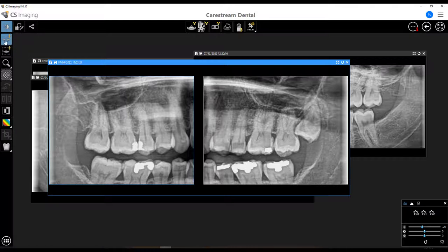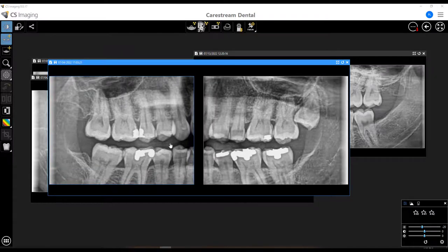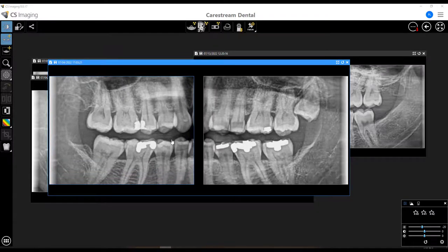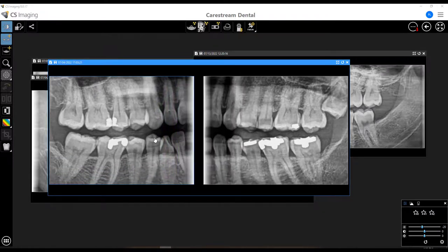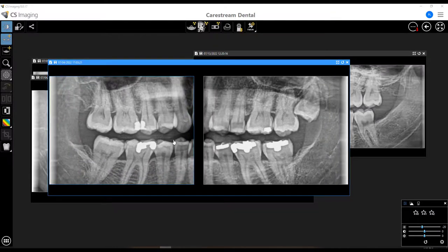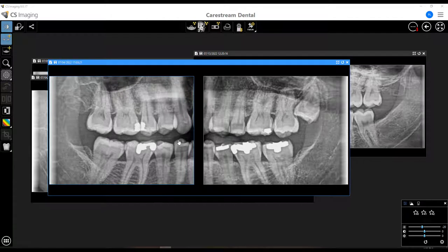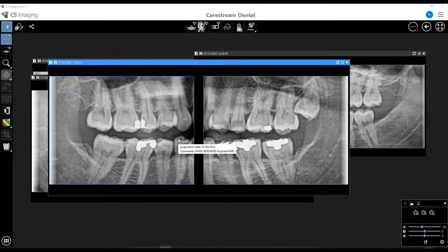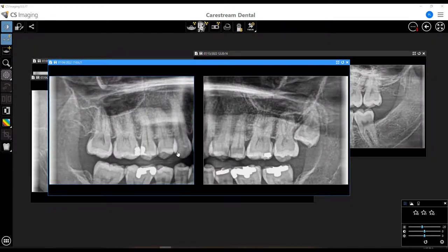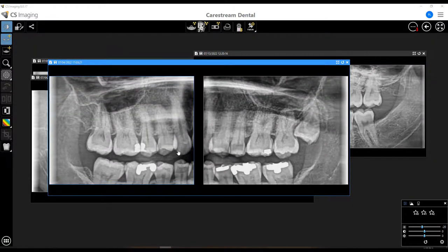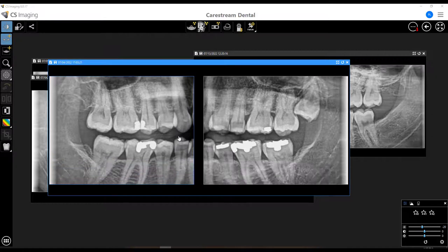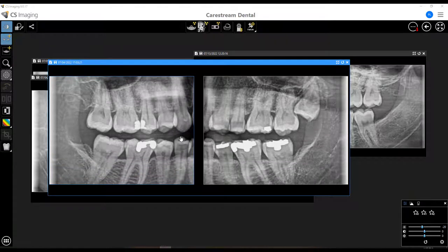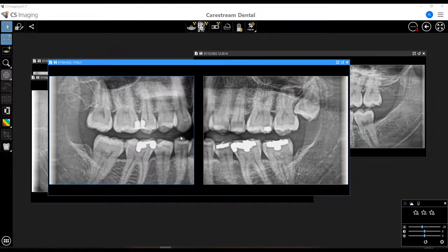As long as that synchronized pan button is highlighted, I can shift my image around to get more of a traditional bitewing look. So even though it might not be captured exactly the way you want, you can just shift it around to get exactly what you want.